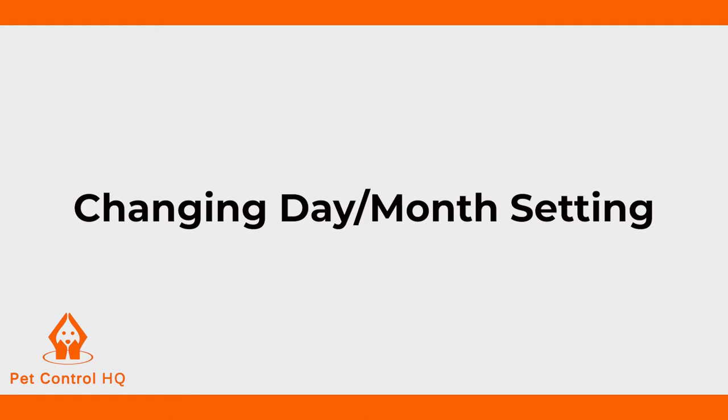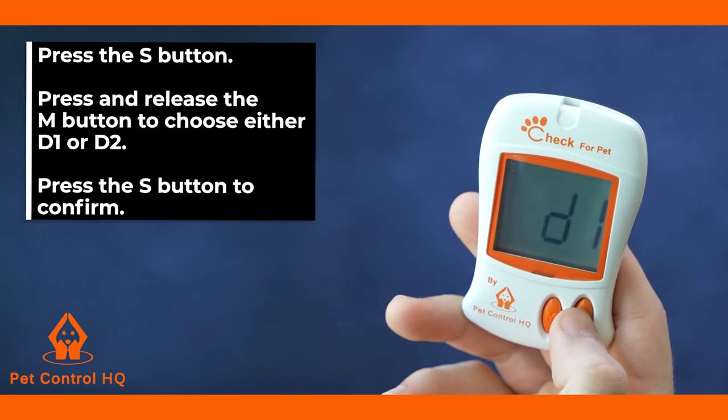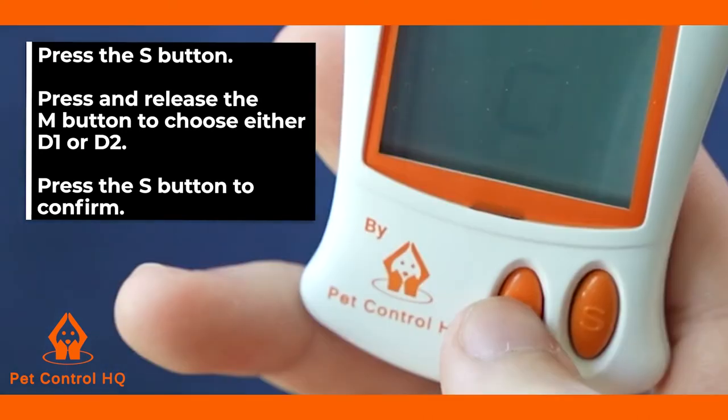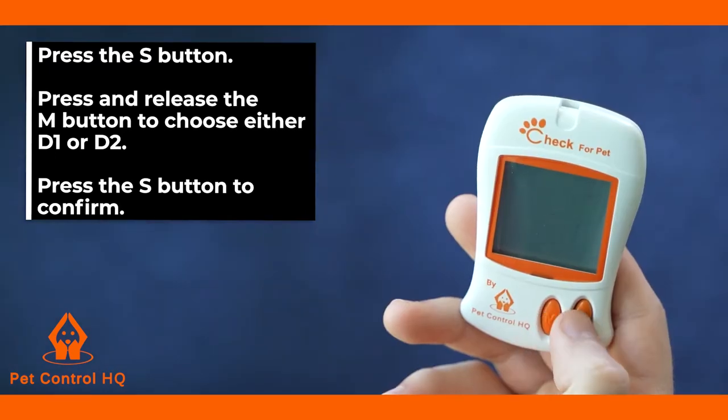To change the day-month setting, press the S button. The date format will be the first to start flashing. Press and release the M button to choose either D1 or D2 to change the day-month setting. Press the S button to confirm.